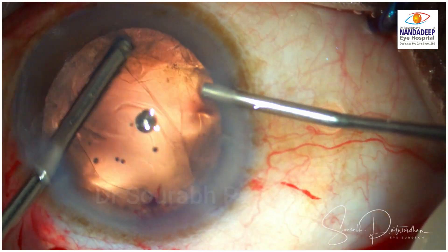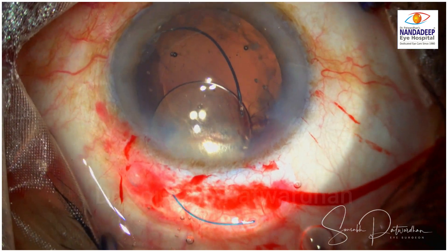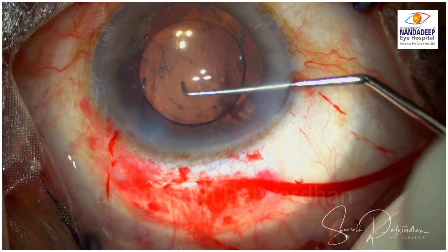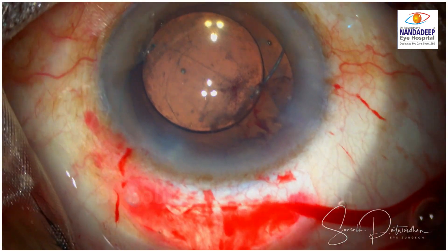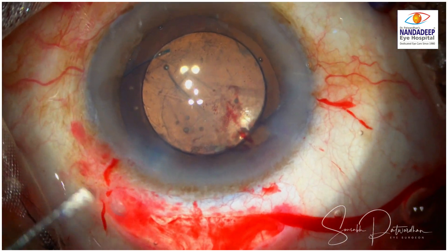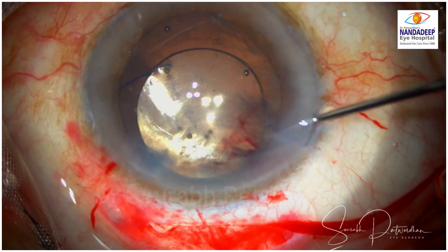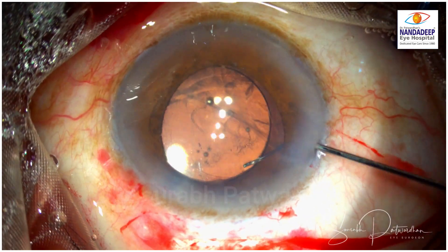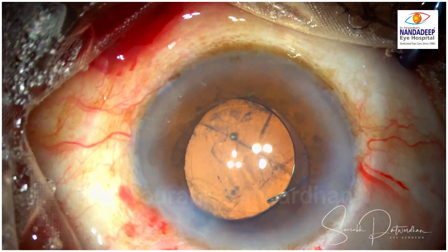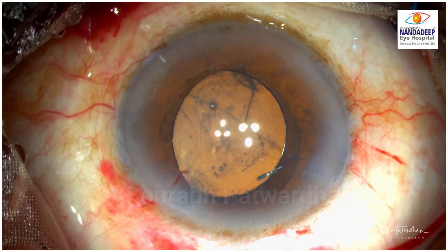The vitreous is cleared from the anterior chamber. I am going to use a three-piece IOL. Now there is a big tunnel so I don't have to use an injector — the trailing haptic first goes in the sulcus. I want to place it horizontally because there is a superior radial tear, so I use the Sinski to push the haptic into the sulcus rather than rotating the IOL, as it may go into the area where there is deficient anterior capsule. The IOL is placed at 0–180 degrees, which is 90 degrees to the radial tear. I am going to suture the scleral incision so that it doesn't induce any astigmatism in the long run.